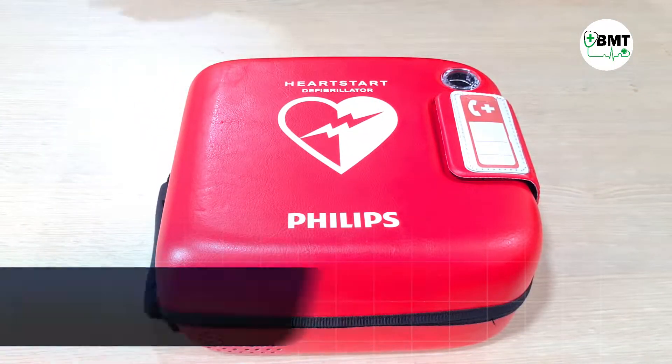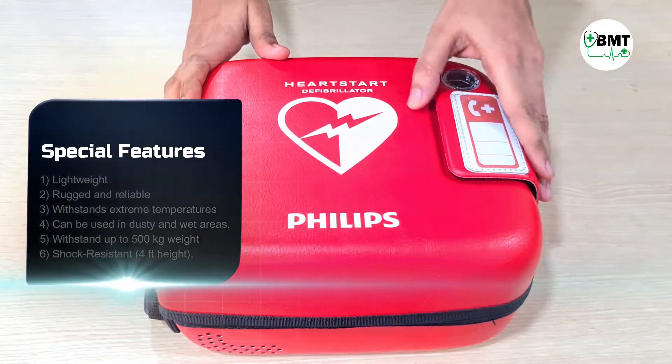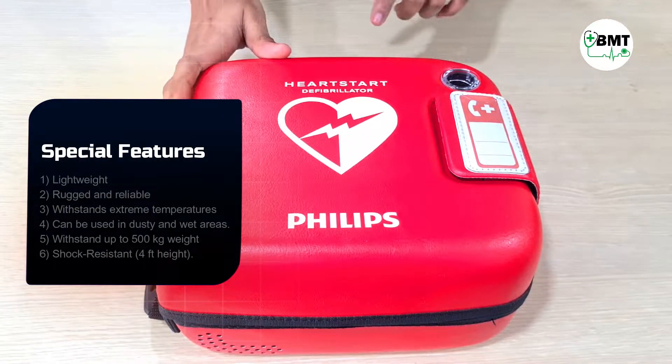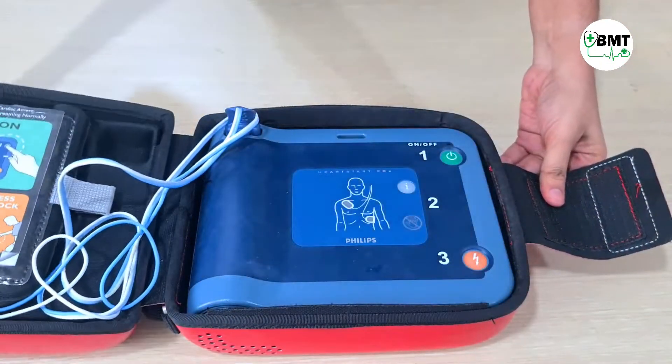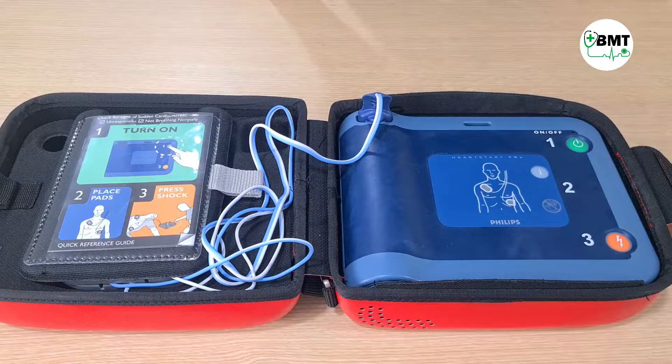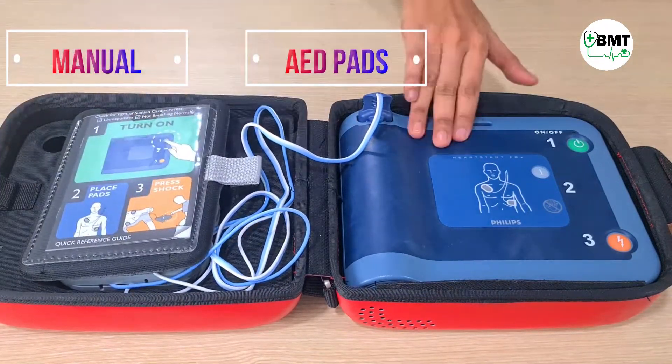This is the Philips HeartStart AED — Automated External Defibrillator. Here you can write the emergency number. Open it. This contains a manual, pads, and the machine.